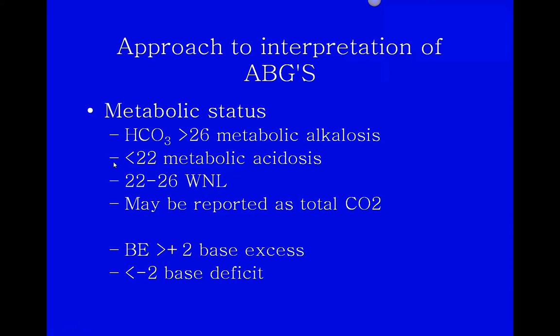Anytime the bicarbonate changes, it moves the pH in the same direction. Because bicarbonate is considered a base in the body, or a buffer, when bicarb levels go up, the pH goes up. The blood becomes more alkaline. So this bicarbonate is above its normal limit. When bicarb goes up, that moves the pH upward, and an upward pH is an alkalosis. When bicarb is removed by the body, then we have an acidosis that develops.